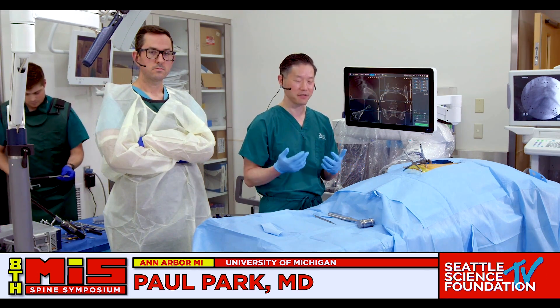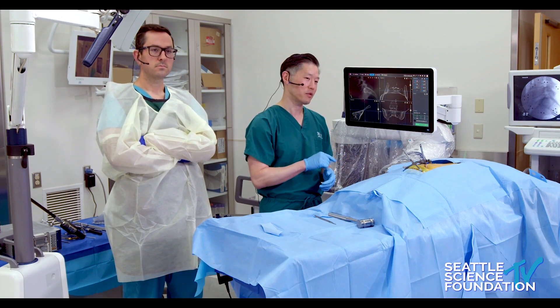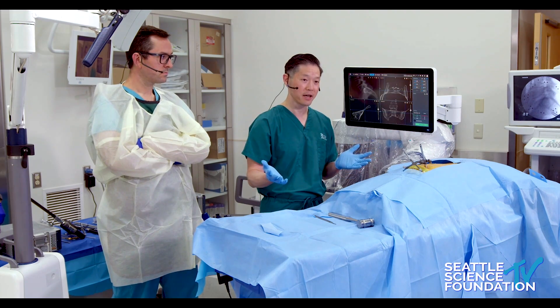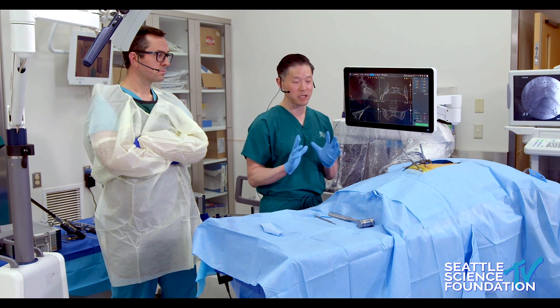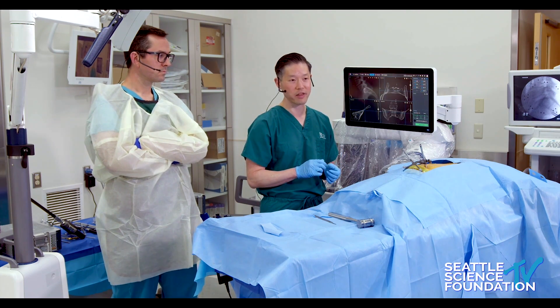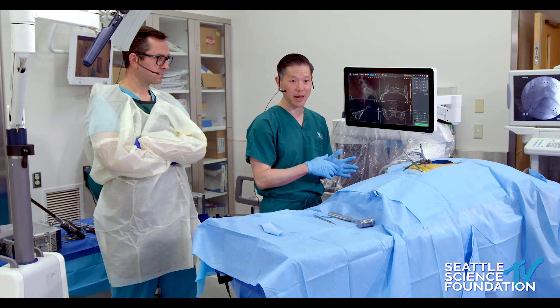We've talked about the value of robotics and the future, but I can tell you that the current generation of robots and SI joint fusion is like a perfect combination. I don't have to wear lead, and it's a very quick operation. The hardest part is planning, particularly because the three-dimensional anatomy of the pelvis is somewhat confusing. I'm going to demonstrate SI joint fusion planning on the robotic system.